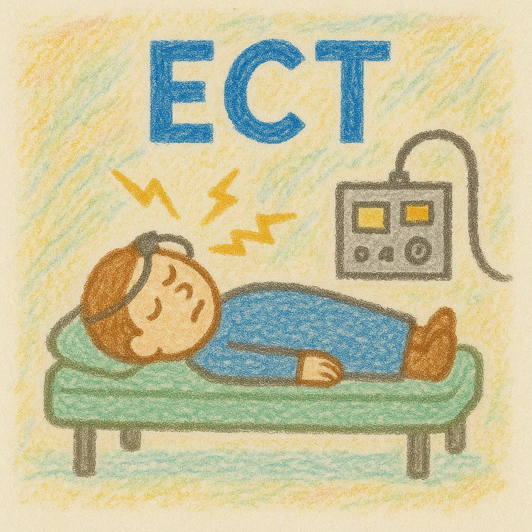So I mentioned the cuff technique. We put a tourniquet typically on the right ankle to prevent the succinylcholine from perfusing to the right ankle, because the succinylcholine is going to make them paralyzed, and we want to be able to see that they're having a generalized tonic-clonic seizure. So by preventing the succinylcholine from getting to the right ankle, we can see at least their foot moving. That's also helpful just because sometimes the EEG machine, the lead might fall off or something. So having two ways to see that they're having a seizure and that it has ended is really helpful.